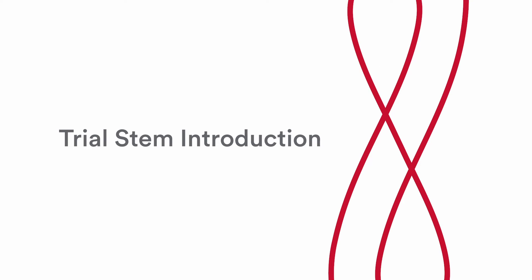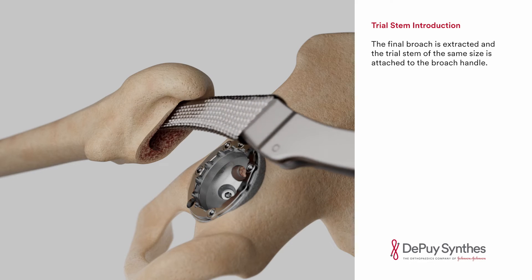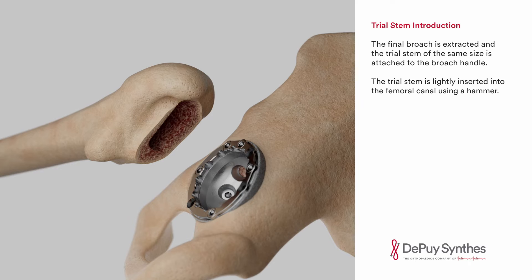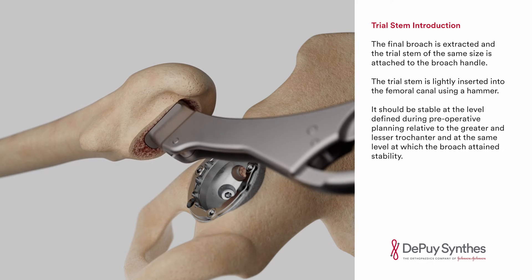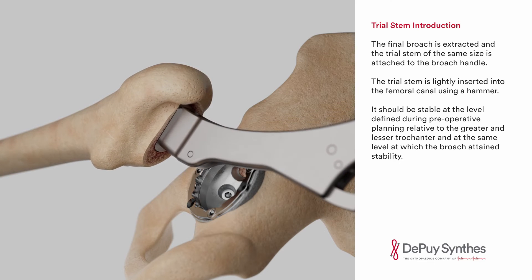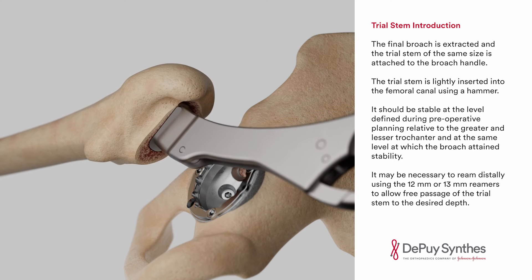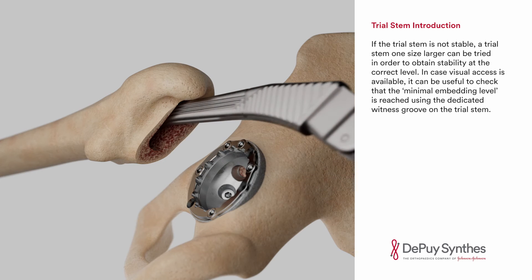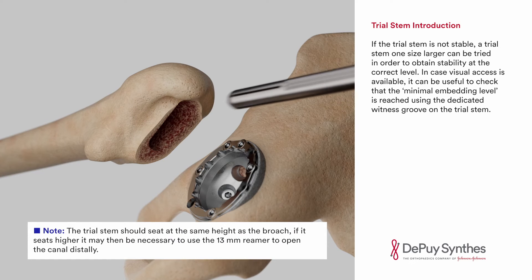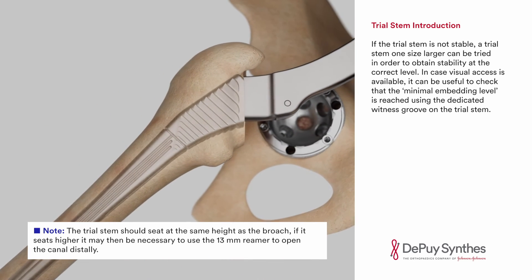Trial stem introduction. The final broach is extracted and the trial stem of the same size is attached to the broach handle. The trial stem is lightly inserted into the femoral canal using a hammer. It should be stable at the level defined during preoperative planning relative to the greater and lesser trochanter and at the same level at which the broach attains stability. It may be necessary to ream distally using the 12mm or 13mm reamers to allow free passage of the trial stem to the desired depth. If the trial stem is not stable, a trial stem one size larger can be tried in order to obtain stability at the correct level. In case visual access is available, it can be useful to check that the minimal embedding level is reached using the dedicated witness groove on the trial stem.